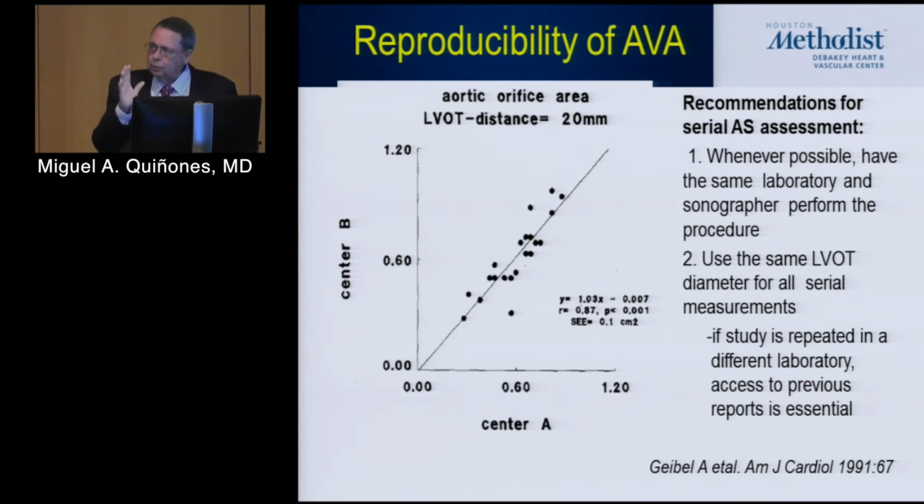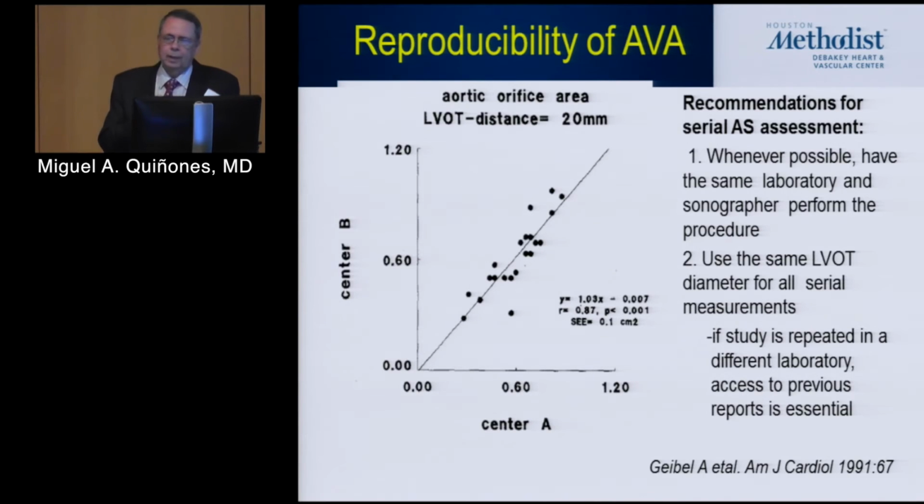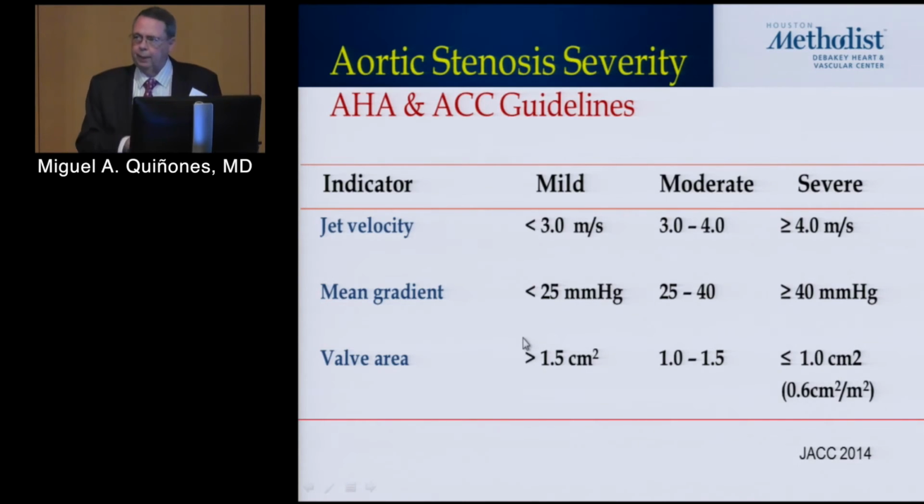Okay? So at least try to accept one number that you feel was accurate. And unless there is a dramatic change in structural anatomy, which rarely happens in these people, stick with that number. Because then, in a way, you're fixing it and keeping a better control. This is a real problem in day-to-day practice.